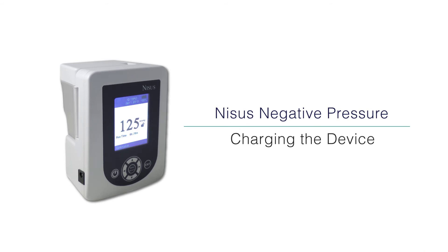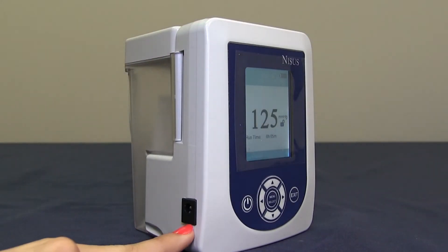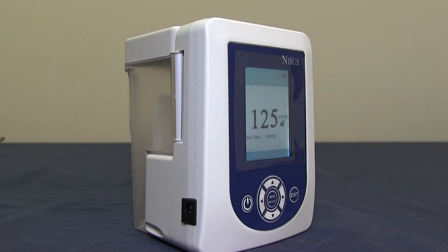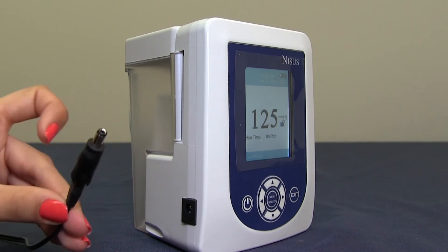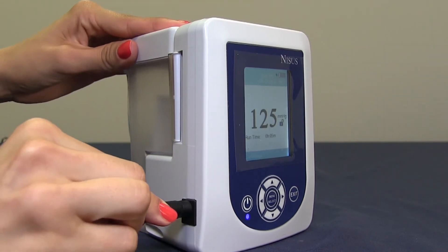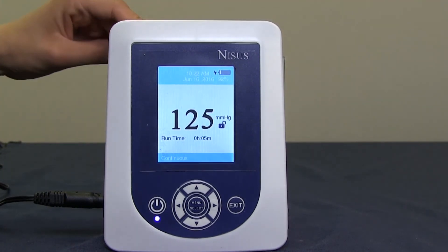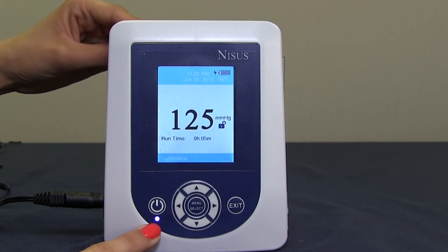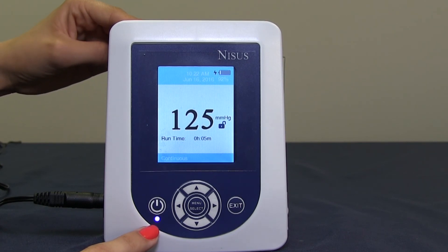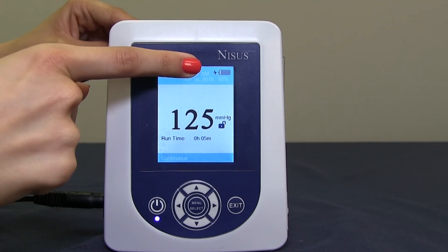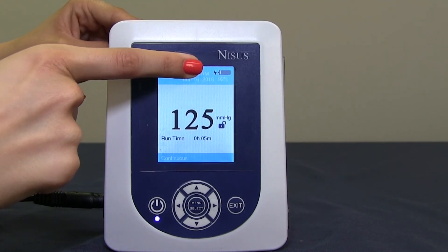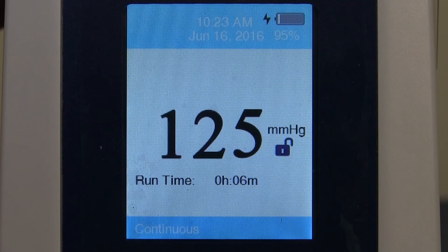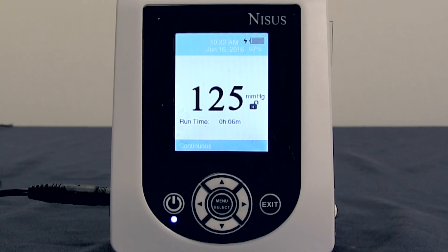To charge your device, locate the charging port, take your charging plug, and plug the device into the battery charger. Now you will see the blue light, which will indicate that your device is plugged into a power outlet. You will also see the lightning bolt displayed next to the battery indicator, which indicates that your device is charging. Once your device reaches 100% of battery life, the lightning bolt will disappear, but the blue light will stay illuminated.